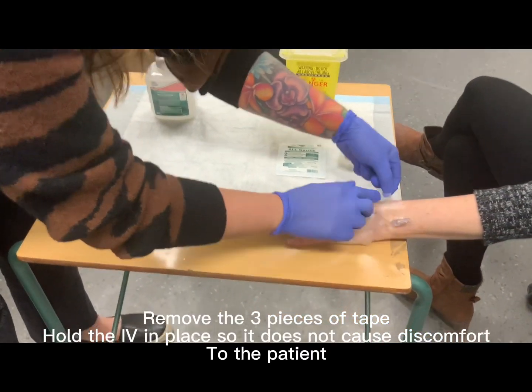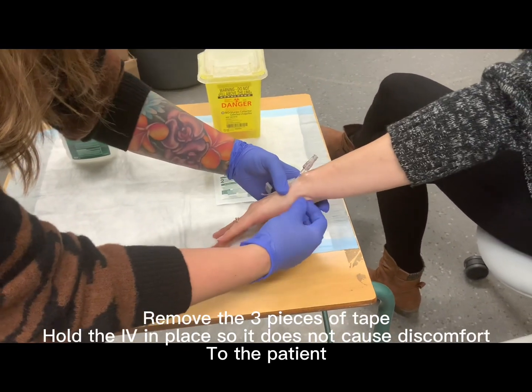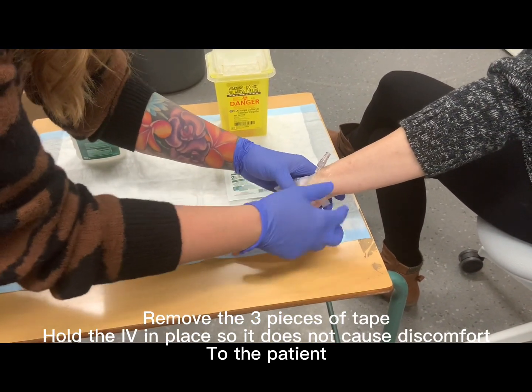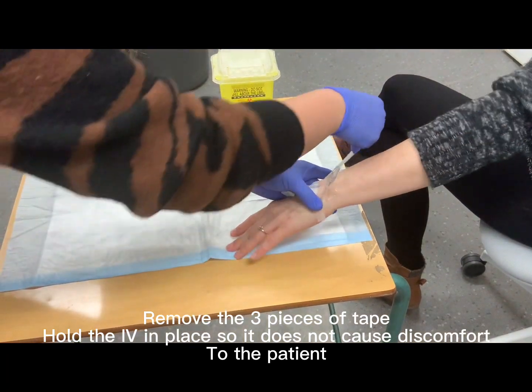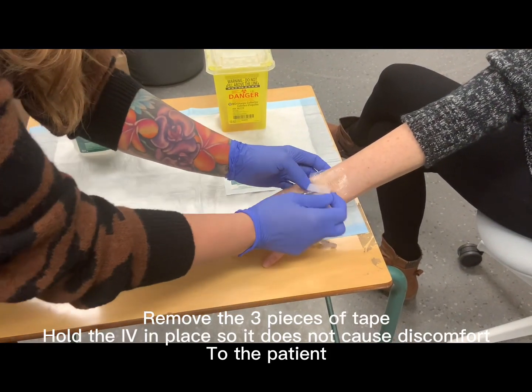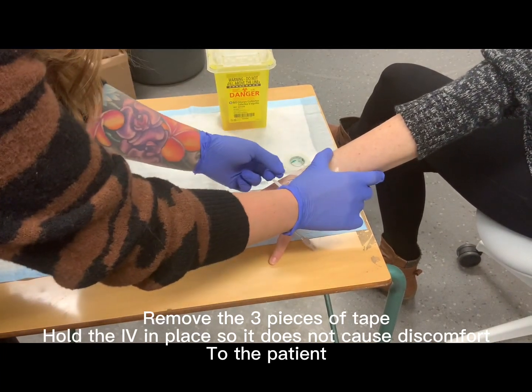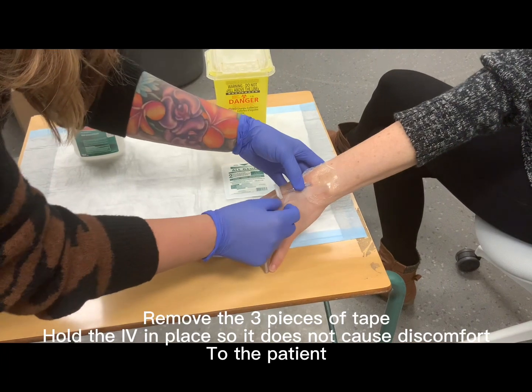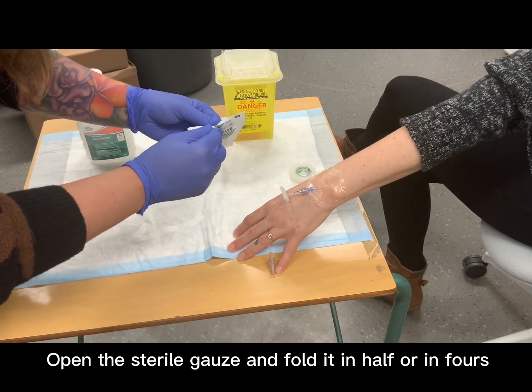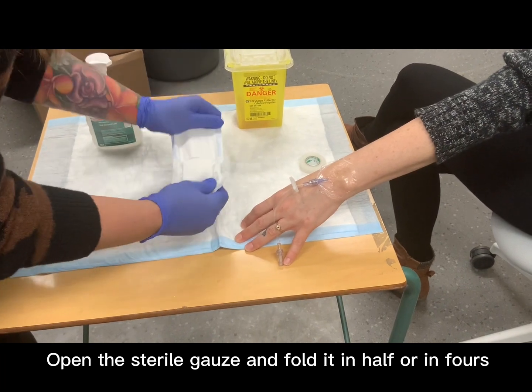Begin by removing the pieces of tape in the reverse that they were put on. Hold the IV down with your fingers so that you don't inadvertently tug on the IV, as this is when the most discomfort is created through this discontinuation procedure. Prepare the sterile gauze by opening it and folding it in half or in fours. You can put it in your hand while you complete the discontinuation procedure.